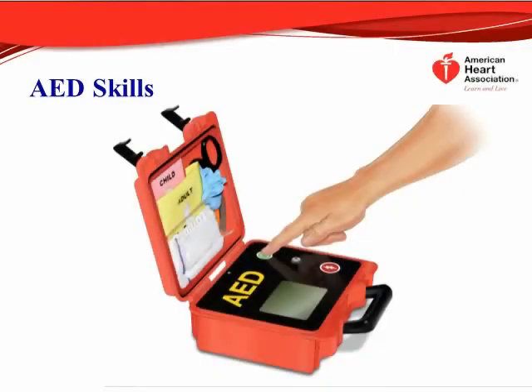The 2010 guidelines reflect that an AED is simple to use and requires only 2 steps. Turn it on and follow the prompts. Following the prompts is primarily a cognitive skill.